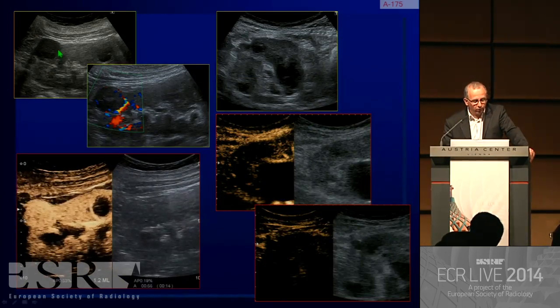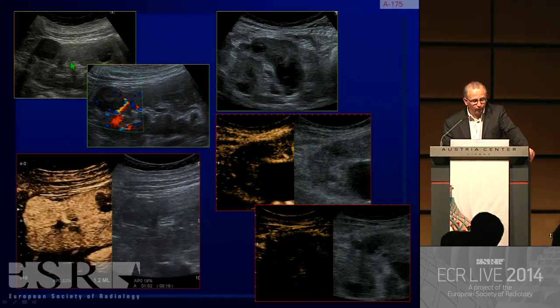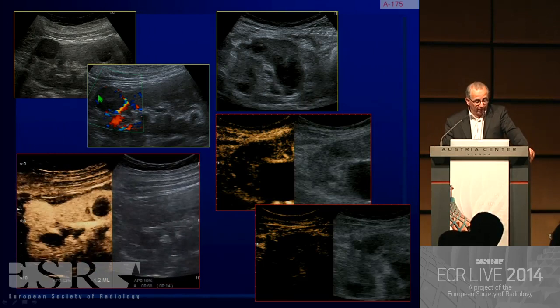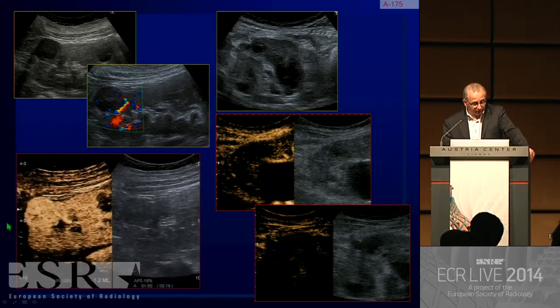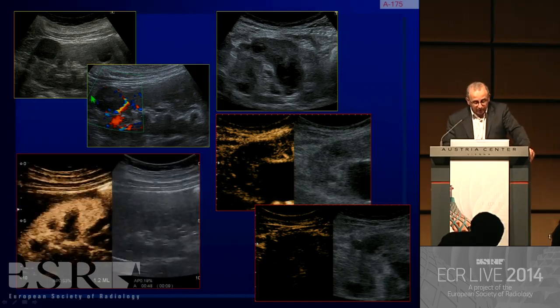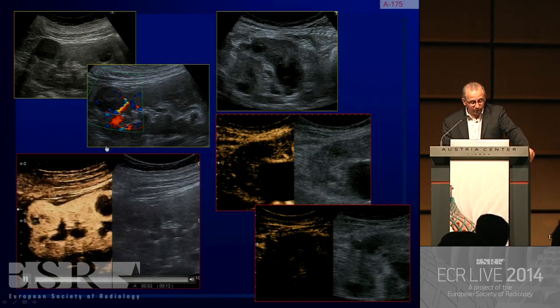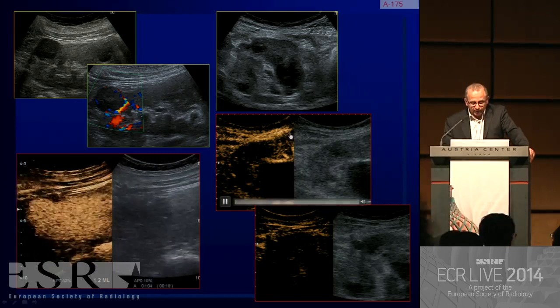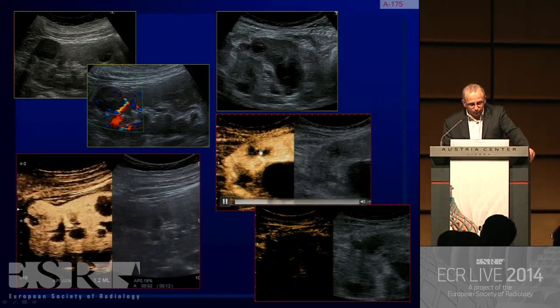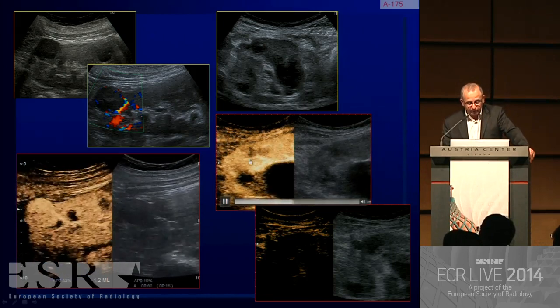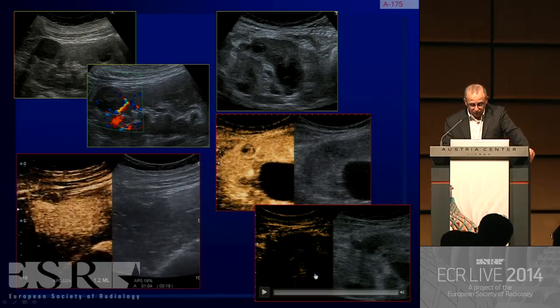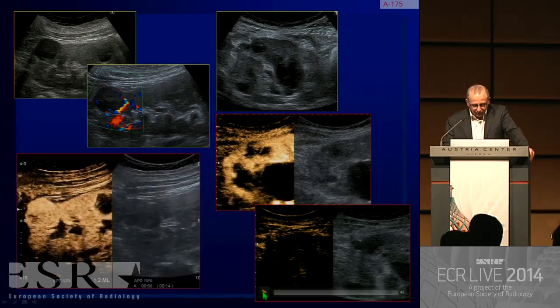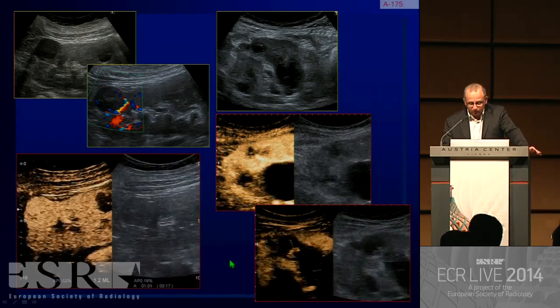Remember that a hypoechoic mass is not necessarily a cyst. A clear example is a lady who had a five-year follow-up for a so-called cyst that was not a cyst at all — when referred to our department, administration of ultrasound contrast agents immediately revealed a renal cell carcinoma. Some renal cell carcinomas can be strongly hypoechoic. Contrast agents are useful for detecting vascularity, as in small cystic renal cell carcinomas. Newly introduced higher-frequency transducers improve delineation of vascularity — from the conventional 1–6 MHz transducer to the 3–10 MHz convex transducer.